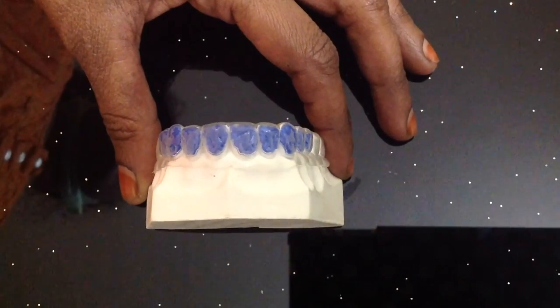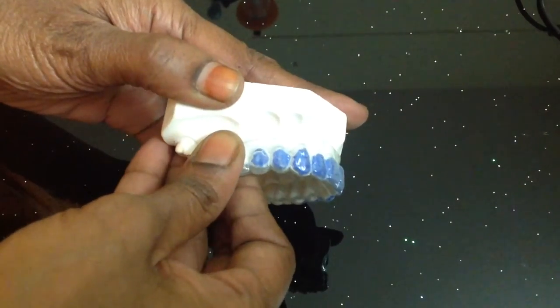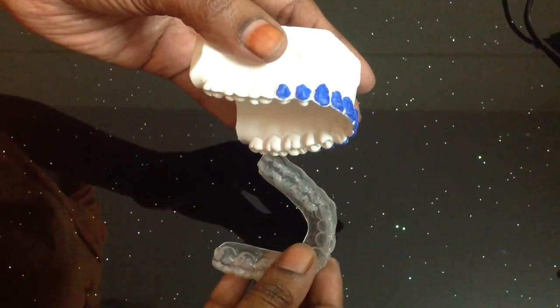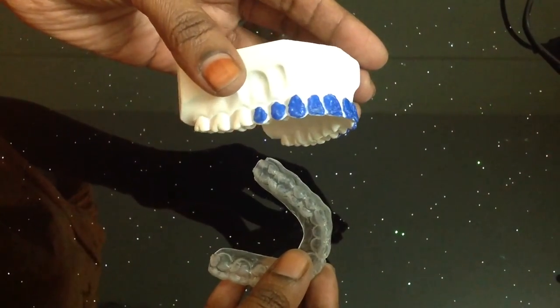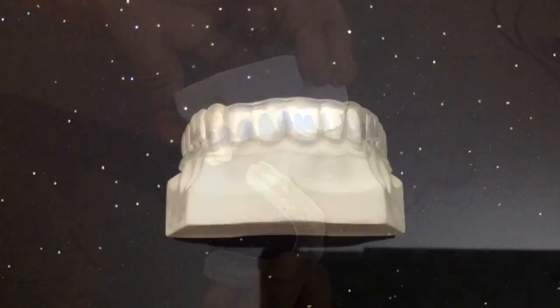The second widely used variety of bleaching tray is made by using the Ultradent Blue Blocker flowable composite as spacer. This takes considerably longer time as we have to light cure each spacer tube before proceeding for fabrication.